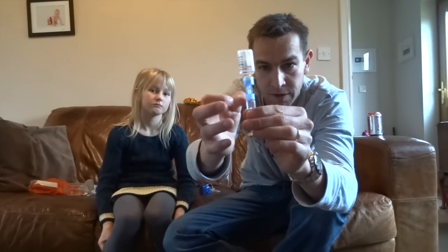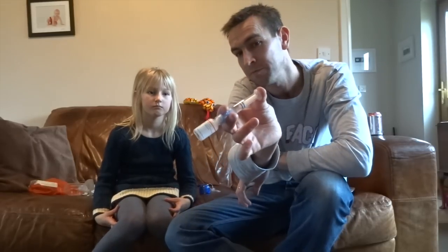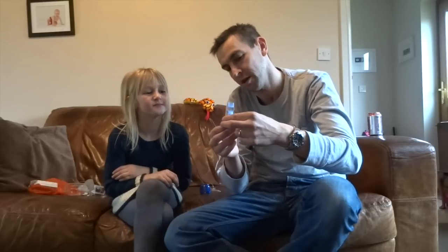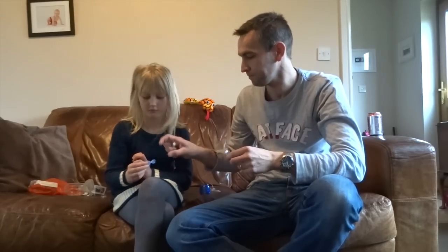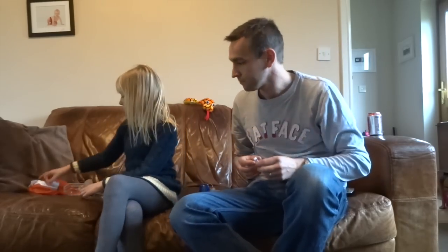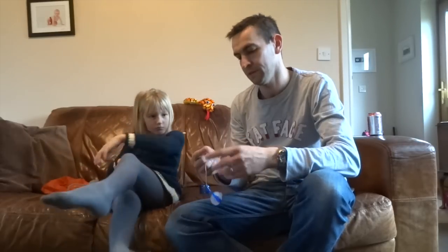We'll push it back up and check for bubbles — there's always bubbles. The way I do it, holding it in, I just tilt it that way, making sure there's no bubbles floating around on the inside. Let's turn it over, take it out. That bit goes in our sharps bin. That one goes that way. That goes back in the box.